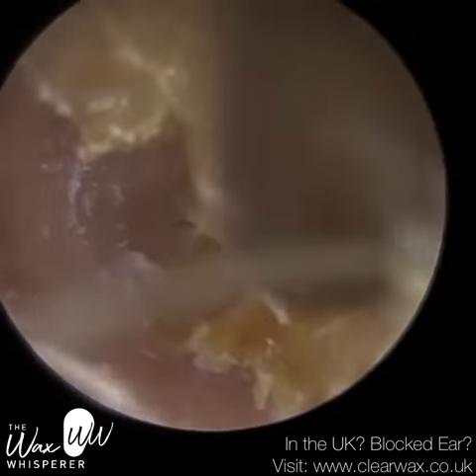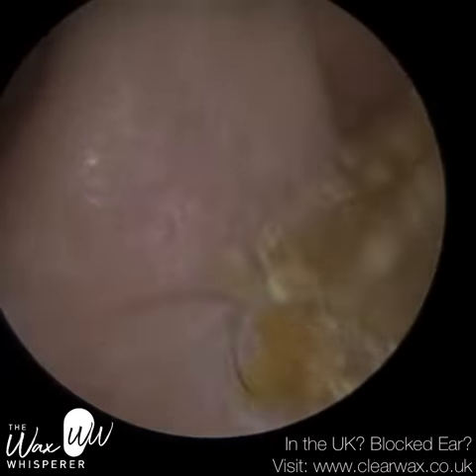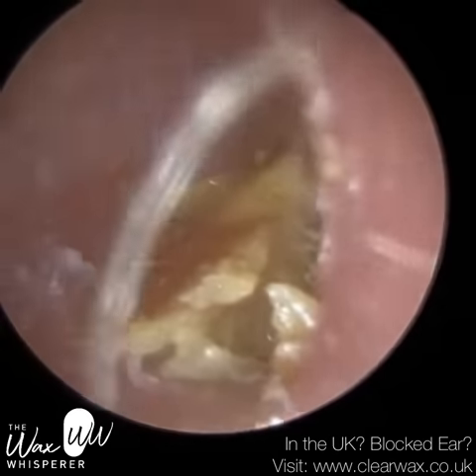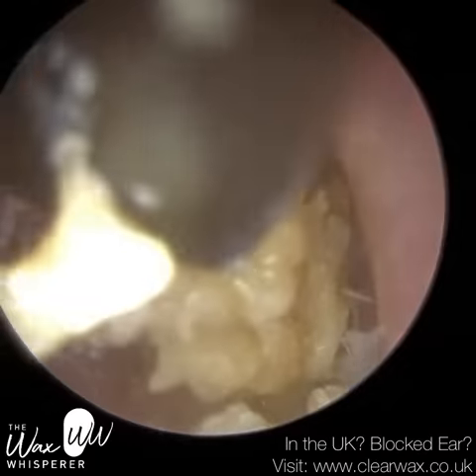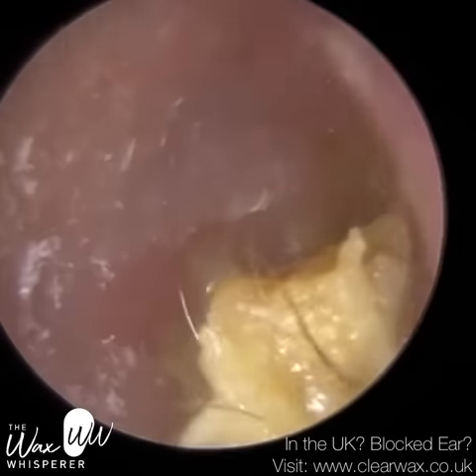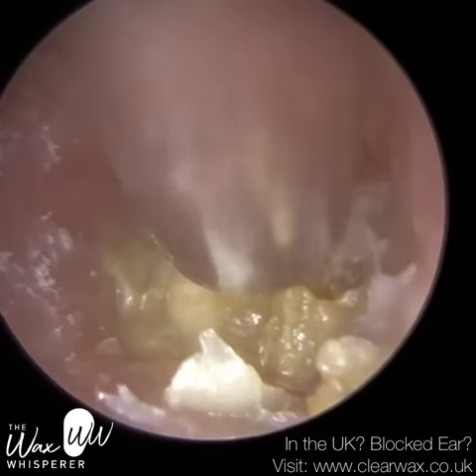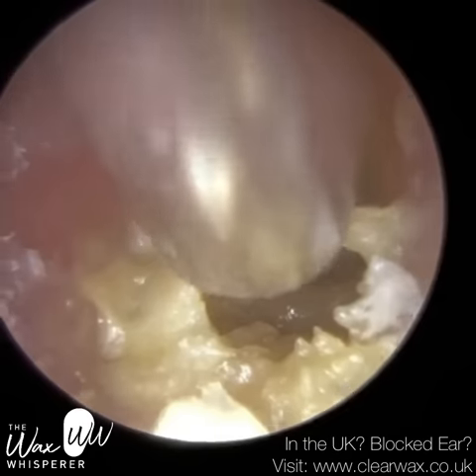They had this attempted to be removed on a couple of occasions and were advised it was too deep in the ear. As you can see, it's pretty straightforward, so I'm not sure what quite happened. But in response, the patient has been using a lot of drops, and more medially towards the eardrum you can see it's become quite mushy — the wax and skin have become macerated. Remember, earwax is made up of 60% dead skin on average. So excessive use of drops not only can affect the ear canal flesh, but it can also macerate the earwax itself — soften it. In fact that's why the drops are used, but this is just excessive.